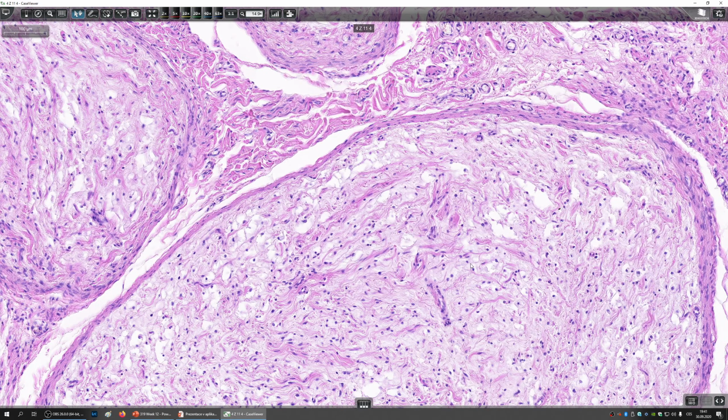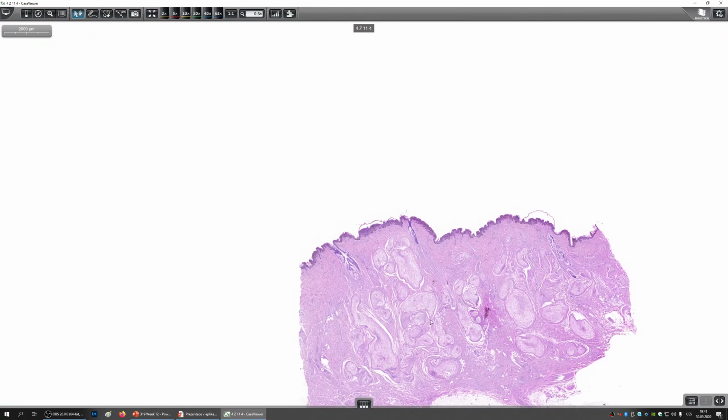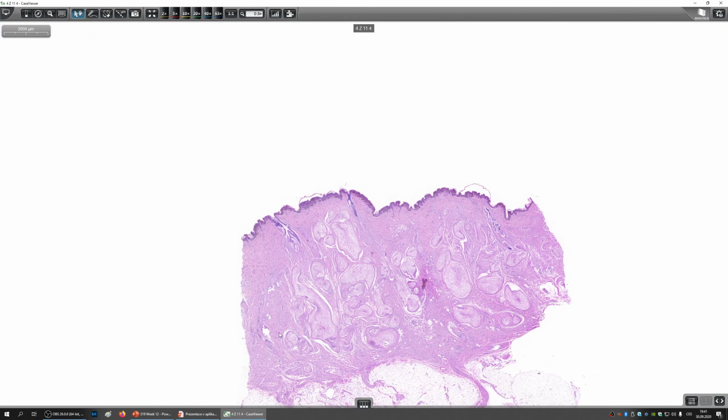This one is a bit myxoid, so there's a bit of mucin accumulation. This could be Alcian blue positive in theory, but it means nothing for the diagnosis here. So plexiform neurofibromas are huge and very bothersome tumors which cause big cosmetic distress to the patient, and sometimes there are attempts at removing them, but they usually come back. So let's move on to the next one.